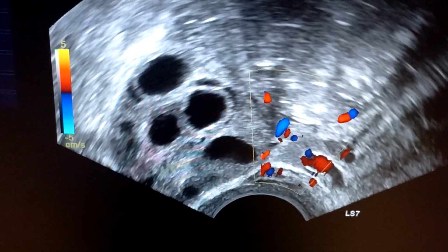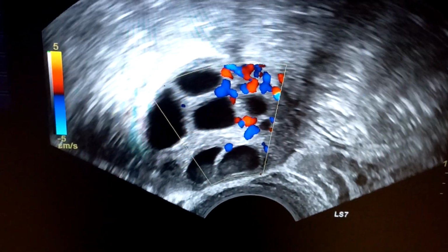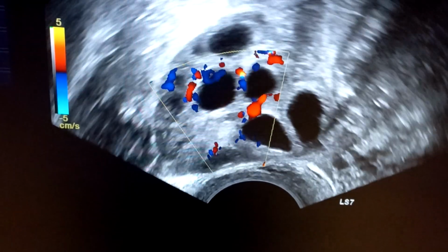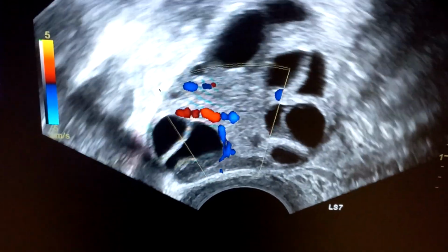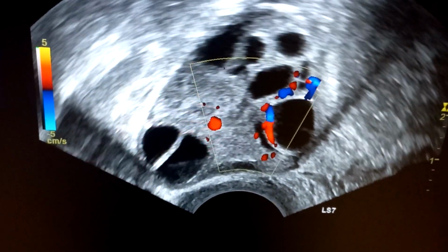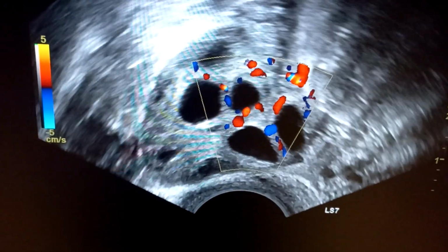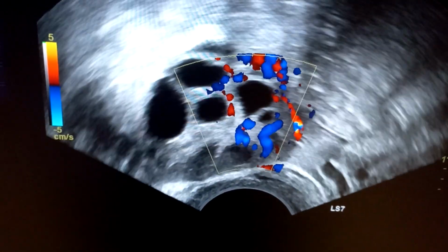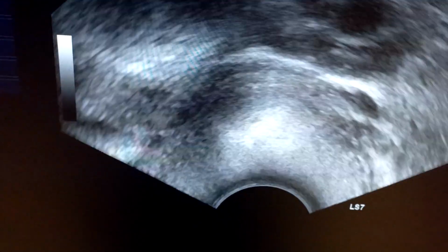Let's put the vascularity. This is called the color box. When we put the color box, you can make out that the ovary is catching the blood supply very well, and we can almost assure that we will be getting some good yield from this ovary. I pray that we get good results, but as a doctor we can never assure what is going to come out, what's the quality of the eggs, but looking at this color profile we feel that this is an optimistic ovary. This is the right ovary of the patient. Now I'll go to the left ovary.